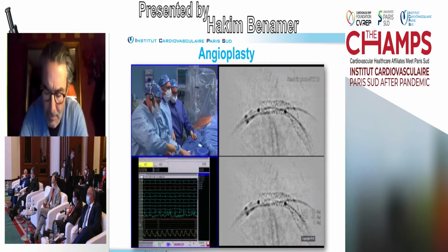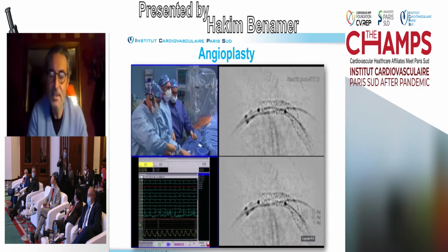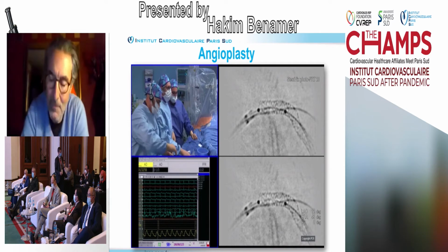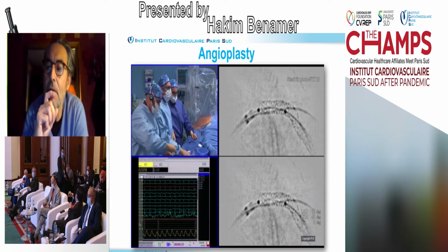I just have a comment that he didn't cover the whole left main. My opinion is that he should cover all the left main, because it's easier later on to do the POT than if you limit the left area of the left main. If I'm doing it, I have to cover all the left main, even if I put a distal stent next. Even though he did an OCT, and the proximal left main is almost normal.